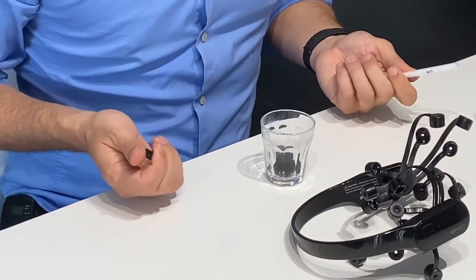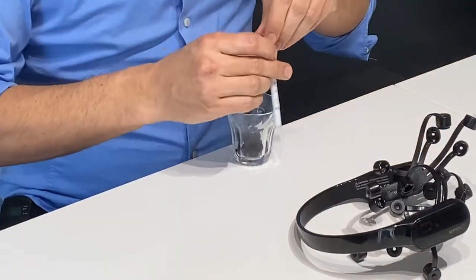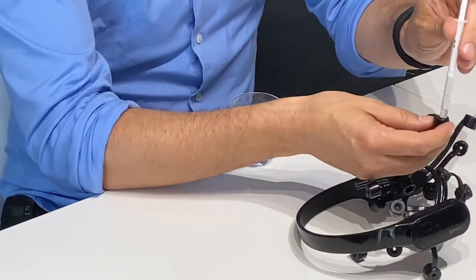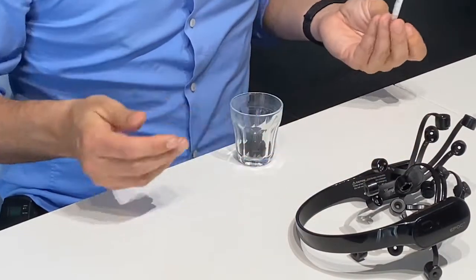The other solution that I wanted to show you is about putting your foam pad here, getting a little bit of saline solution, and you can now just add it here to make sure that it's totally wet throughout the experiment.